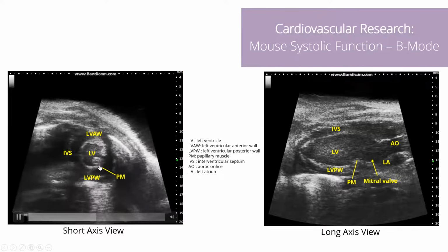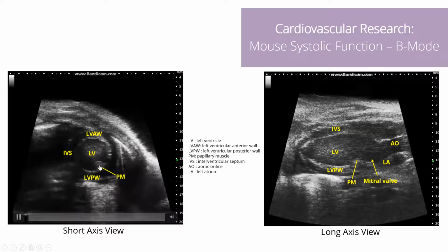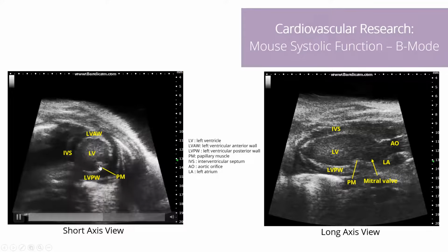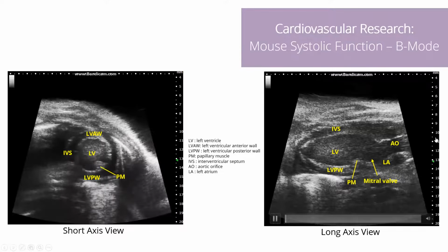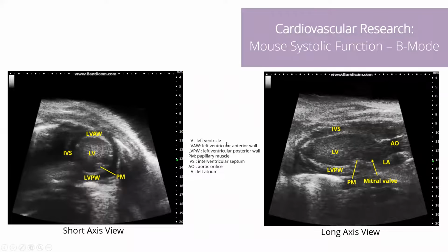And those actually connect up to the mitral valve and allow us, like an anatomical landmark, to know that we're getting our images from the exact same place every single time. And so again, the papillary muscles and a nice round structure are used for the short axis view. And for the long axis view, we do want to see the apex and the aortic outflow to know that we're in the same place each time as we go through our longitudinal study.